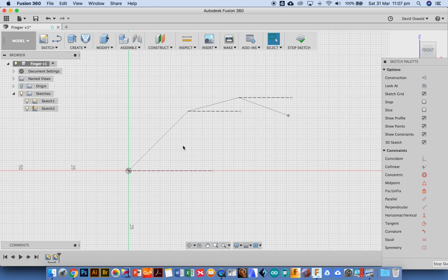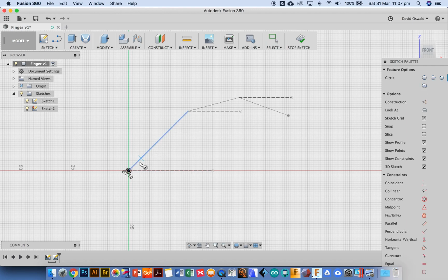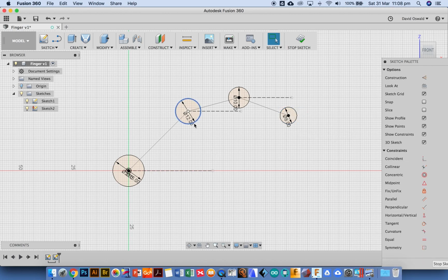There's a small circle in the middle, so if I hit C, there's a small circle where I've got to put a little screw through to hold the arm in place on the servo. I know that's 2.5. 2.5, enter, enter. My first circle is 15. The next circle, so C, lock on, 12, enter, enter. C, lock on, 10, enter, enter. And last of all, 8, enter, enter. Again, I don't want these measurements all overlaying the circle, it's too confusing, so let's just drag out some measurements.